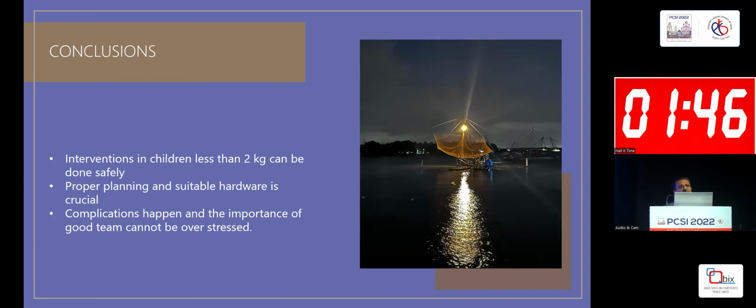You're talking about preterm babies, stenting regular babies? I suppose that question was not for preterm. Okay, you wanted it in the preterm frame? Smaller babies, okay. Preterm, I think it's sufficiently difficult. So I usually deploy it in one of the easier pulmonary arteries that's available.